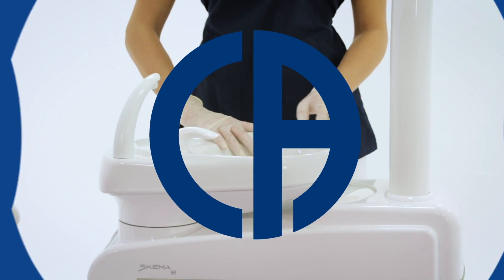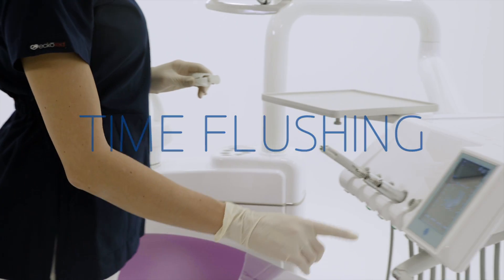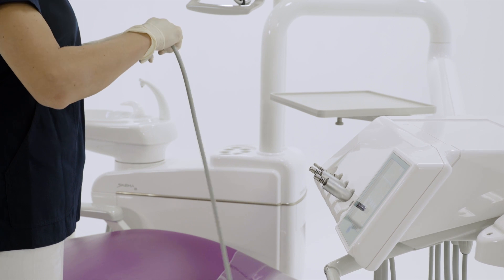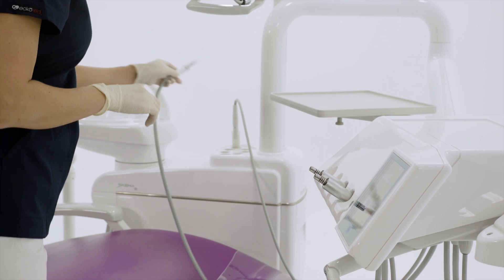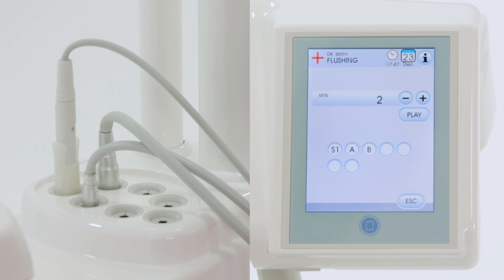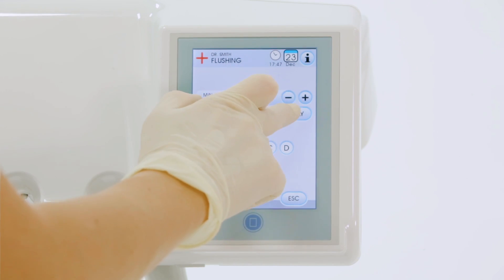From the full touch control panel, the assistant prepares to run the flushing cycle before removing the instruments, setting a personalized cycle time. Then the instrument hoses are placed in the specially provided tub.